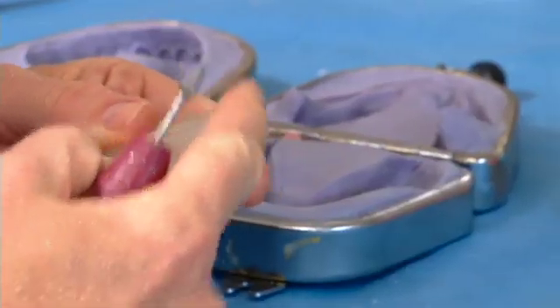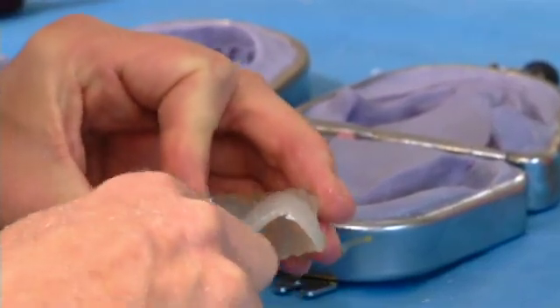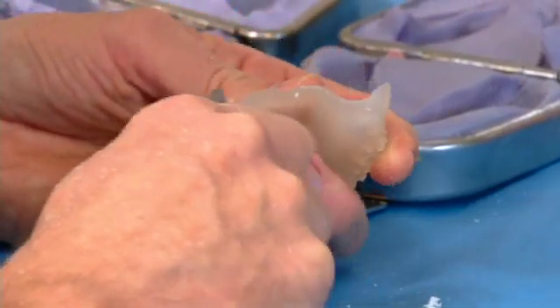Now, sometimes you'll get a little lip on the posterior aspect. I'm just going to trim that right off of there because you don't want that to keep the denture from going down in a patient's mouth.